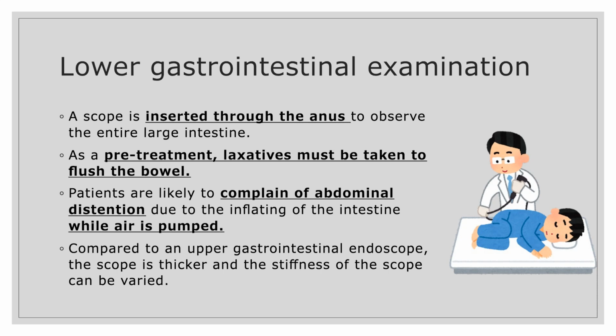The examination is performed while the bowel is distended, so abdominal distension is easily felt. The transverse colon and sigmoid colon tend to stretch the intestine, and the patient often complains of pain when stretching the intestine. Compared to the scope used in the upper gastrointestinal tract, it is characterized by its larger diameter and its ability to vary its hardness in steps.